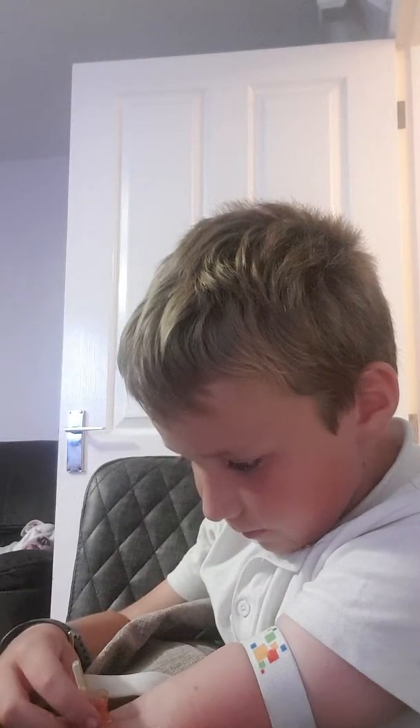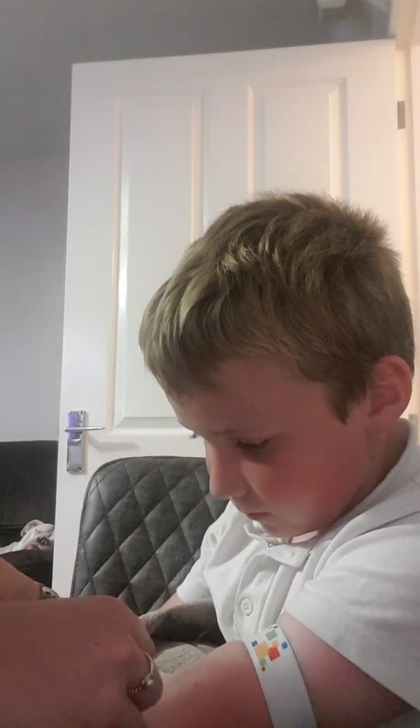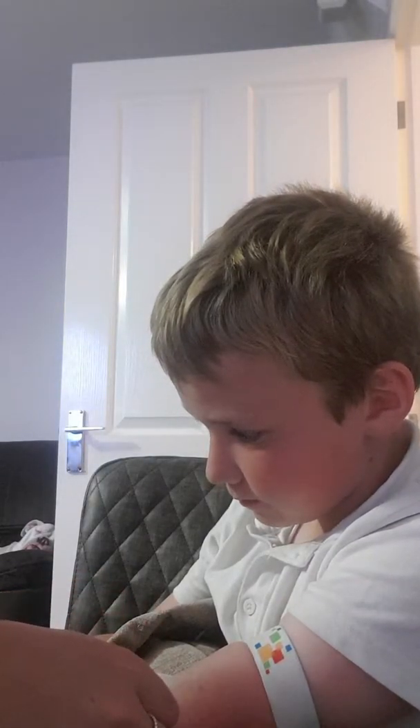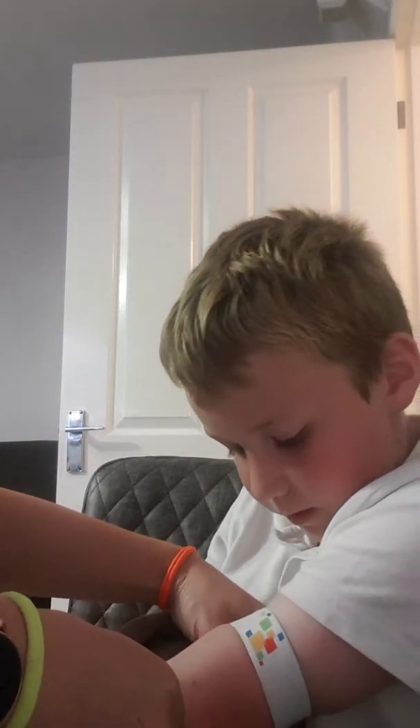There we go — going a bit further. Up there, perfect. All right, try and release your tourniquet.